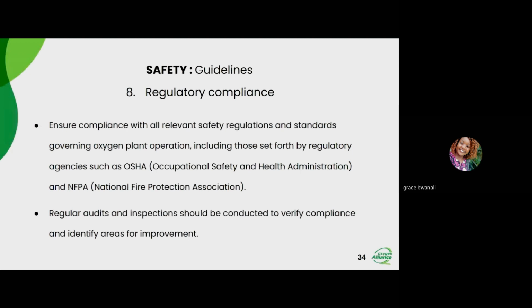This includes a set of procedures, or I should say instructions, that are set by regulatory agencies such as the Occupational Safety and Health Administration, OSHA, or the NFPA, the National Fire Protection Association. These help give manufacturers the regulations that they are supposed to follow.